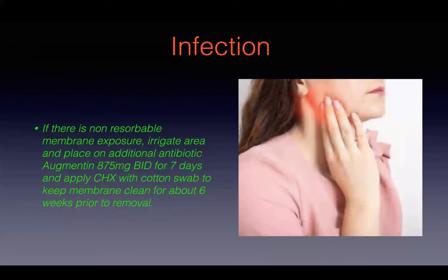So in the picture on the left, I've already placed implant number 7, getting ready to place implant 10. And on the second picture, I've added the allograft, I'm packing it in. And in the third picture, I'm placing the collagen membrane. Because of the amount of allograft volume I added, I didn't want to put tension and obtain primary closure. So I layered it with another non-resorbable membrane there and 4.0 polypropylene sutures with both the horizontal mattress and interrupted suture technique. And that was immediate post-op.